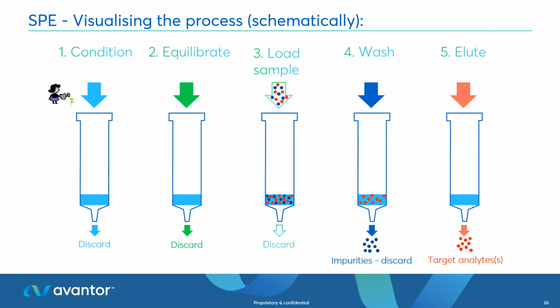However, typically the solvent that we use on that step will be quite a strong solvent. What I mean by strong is it will easily elute our compound of interest off. And so what we then do is we equilibrate the phase by removing the bulk of the organic solvent that we've already applied. We still have liquid in the pores. There's still a small amount of organic solvent that allows that to happen, but the bulk of the solvent will be a very low eluting power solvent.